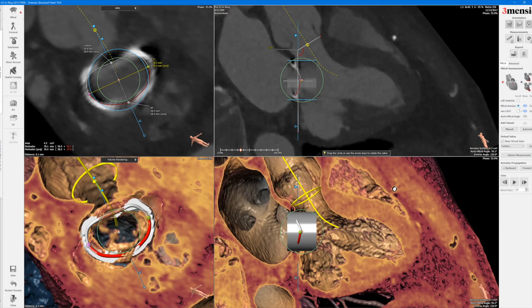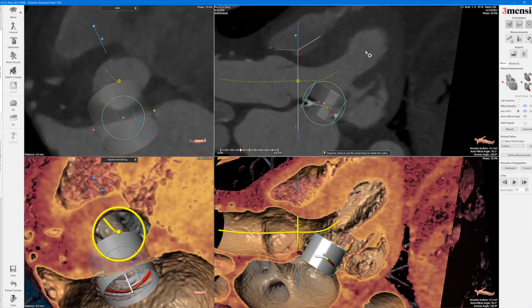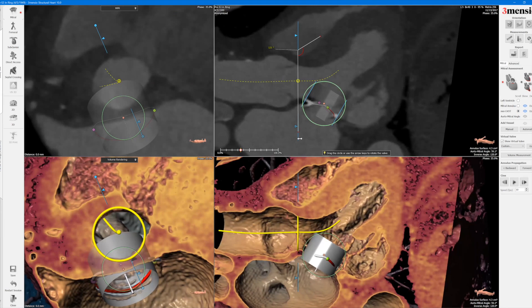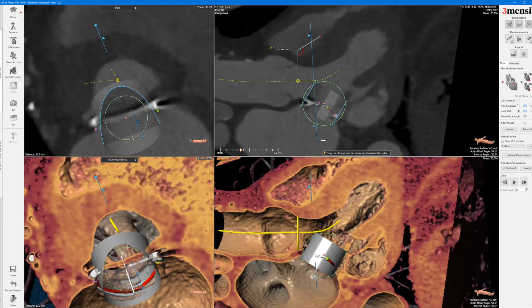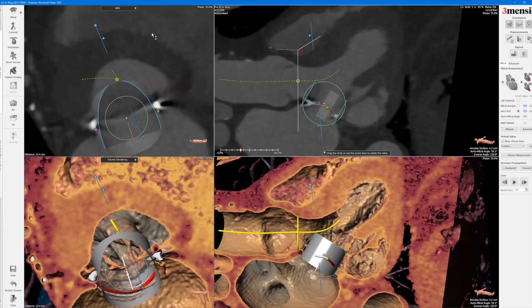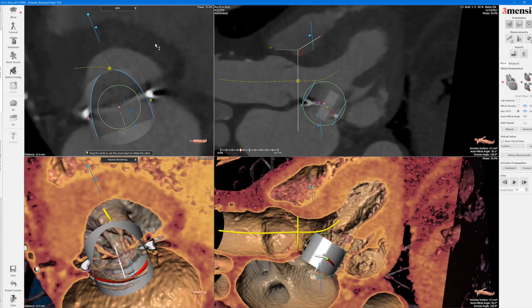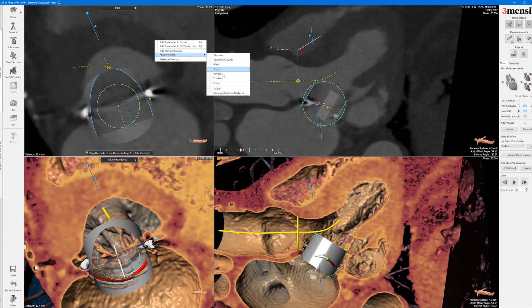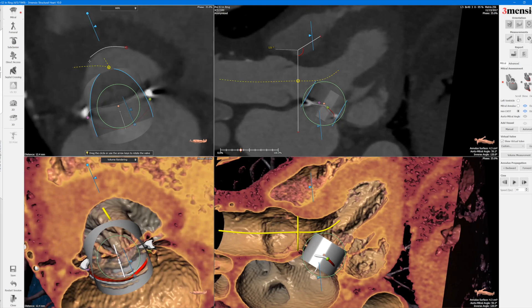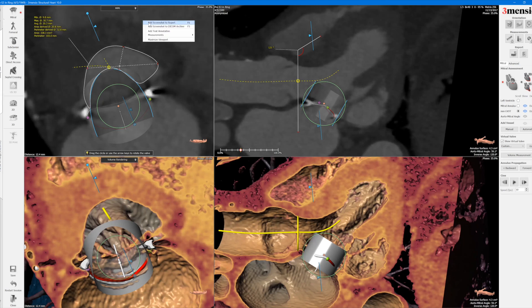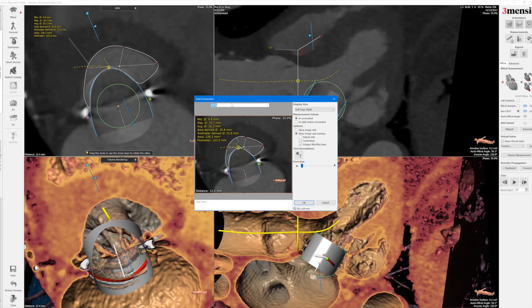Then you can do your neo LVOT — click on the new LVOT dot, take the parallax out of the virtual Sapien valve, go to the smallest portion of the outflow tract, and that is where it is. In this particular patient the LV is so dilated you're not going to have a neo LVOT issue. You can see how I trace it out, then right-click to show your neo LVOT — that's 30%, which would be number one.